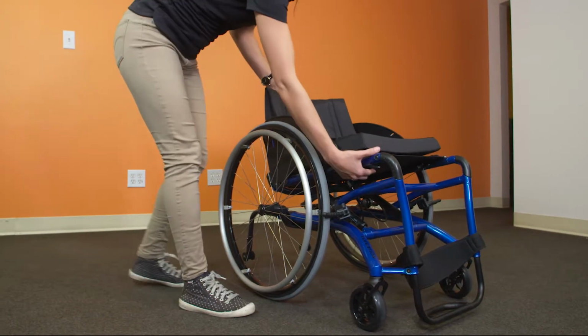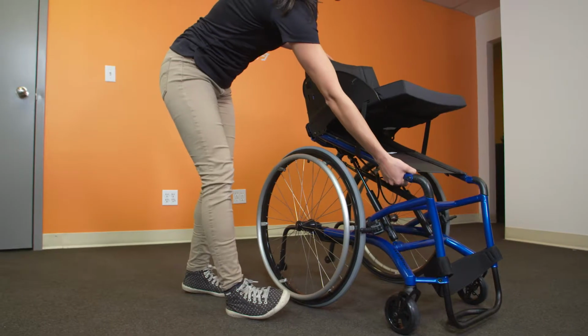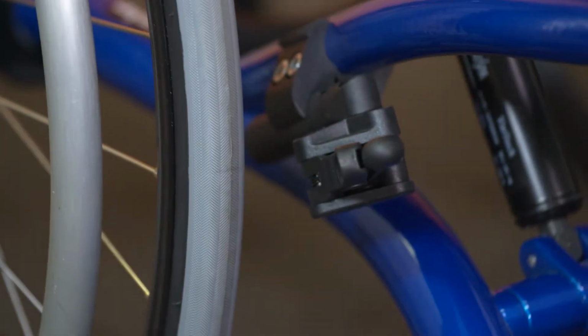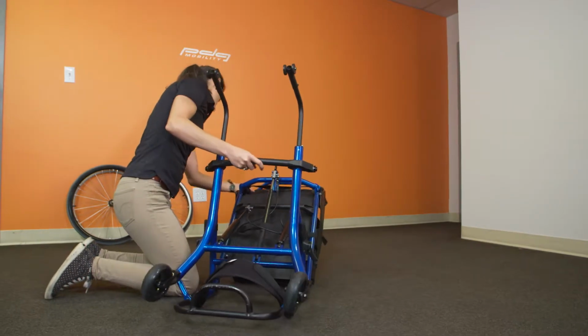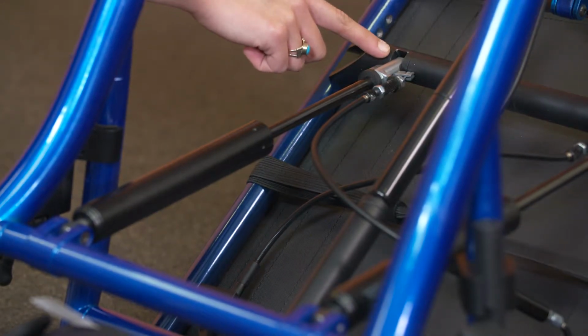Next, decompress the tilt struts by activating the tilting trigger normally located on the right side of the chair. Now you can disengage the wheel locks, remove the rear wheels, and turn the chair over to begin working towards removing the struts. The struts are mounted onto the frame on both ends.